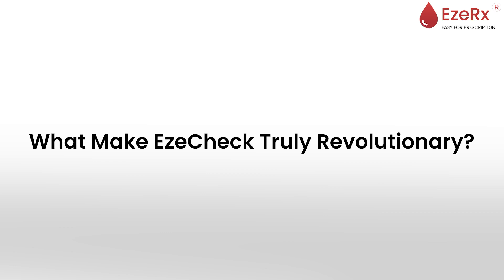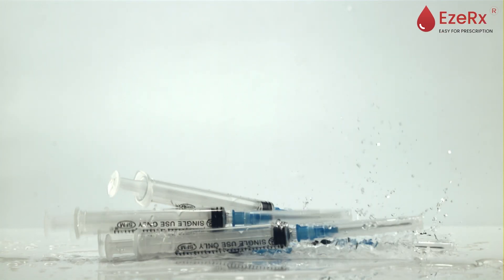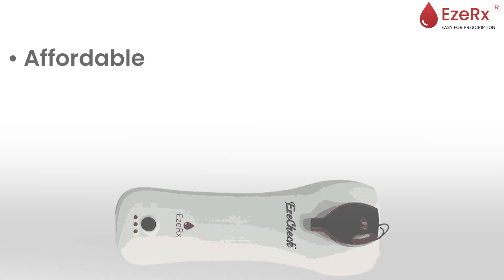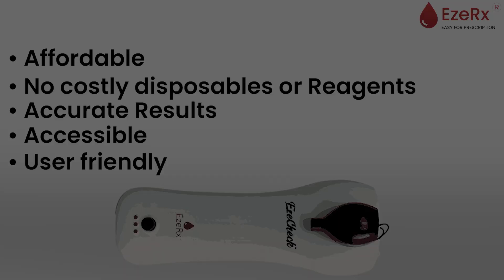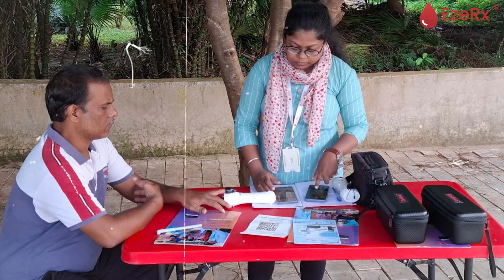What makes EasyCheck truly revolutionary? Non-invasive — say goodbye to needles and blood samples; EasyCheck offers a safer, infection-free experience. Affordable — no costly disposables or reagents, just accurate real-time results. Accessible and user-friendly — with minimal training required, anyone can operate EasyCheck effortlessly.